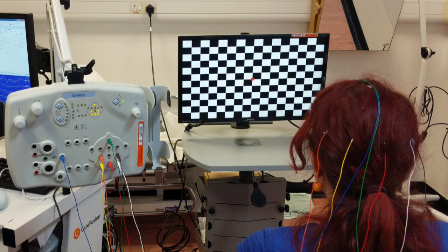It takes about half an hour. The electrodes are applied directly to the skin with a bit of jelly and then some tape over them, and sometimes you have to force the hair apart to get a good landing strip, sometimes even shave a tiny bit of hair to put the electrodes on. And depending on how the visual evoked potential is done, that might mean just 3 electrodes on either side, or 2, or sometimes more, up to 8.